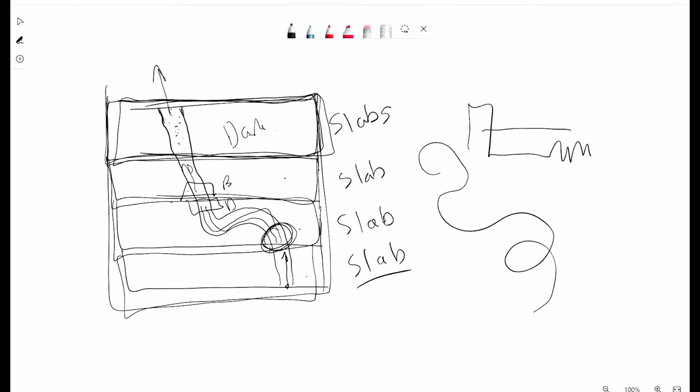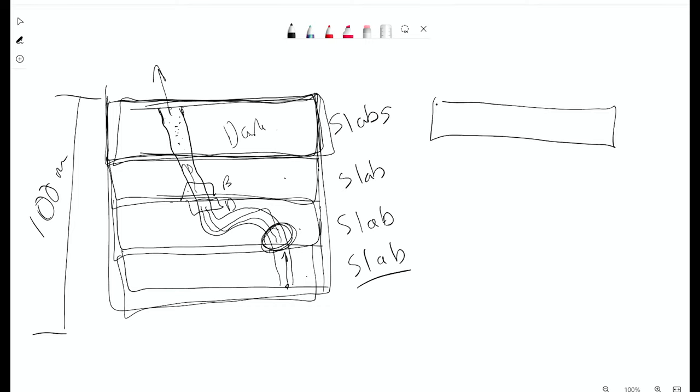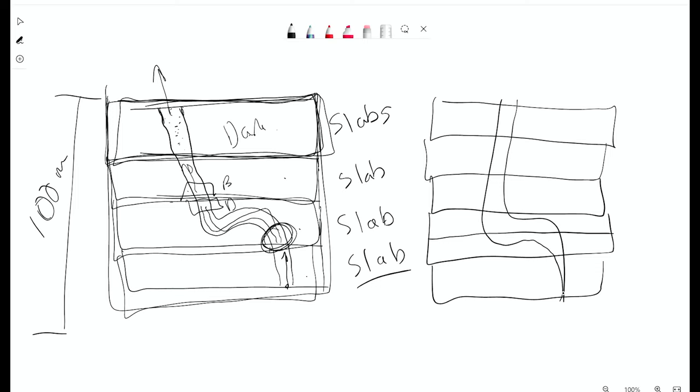And so typically you can do two things. I'm a big proponent of this one instead. Let's say, for instance, in this case, we are going to do four slabs to cover 100 millimeters of tissue. Instead of doing four slabs, I can do five or six, and each one of them is smaller. So instead of four large slabs, now there are five or six. That way, there's less time that it's going to take to actually saturate. That's a quick and easy way, and you're still covering 100 millimeters. You're actually reducing the number of slices inside of these, but you're increasing the number of slabs.